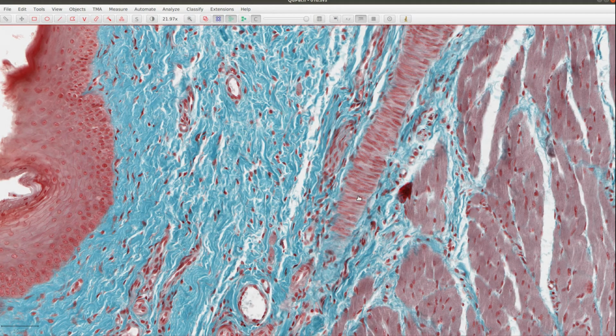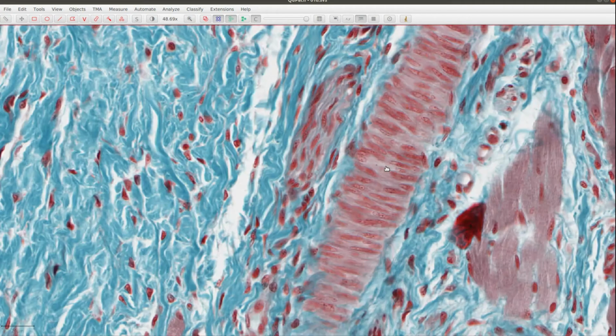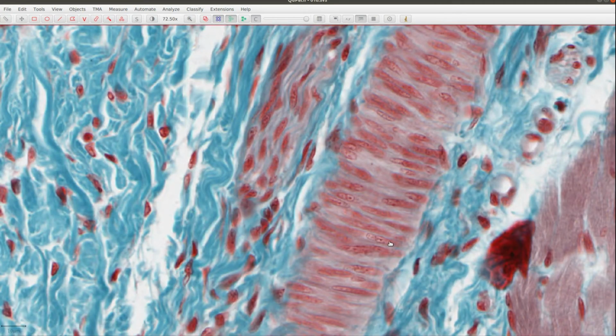This is tissue from a cat's cheek, so we've got some oral mucosa over here and then submucosa underneath it. We have a little nerve running along there and some skeletal muscle here. And then we have this rather odd looking section of some cross-hatch cells. They look like smooth muscle cells because they have their cigar-shaped or sausage-shaped nuclei.